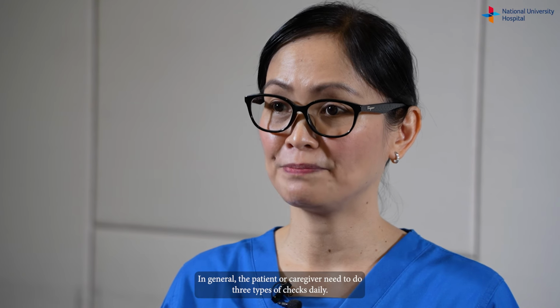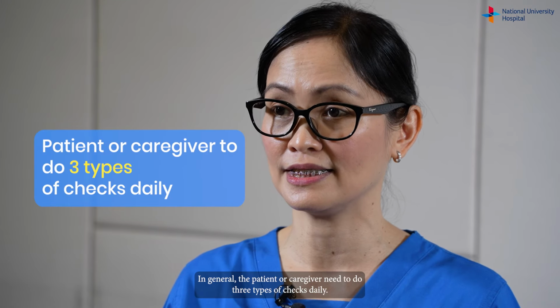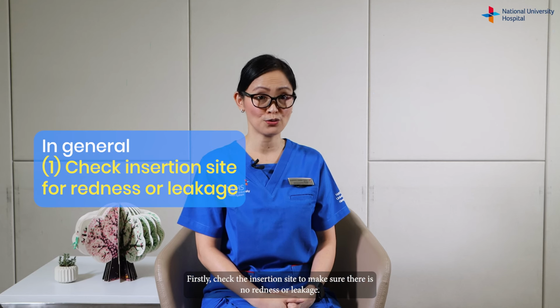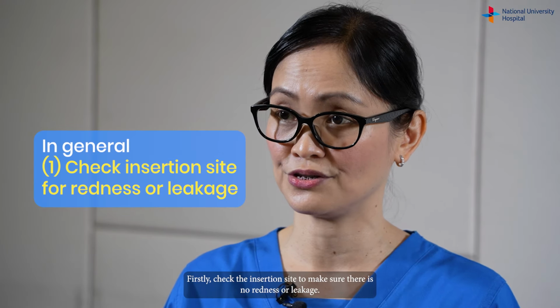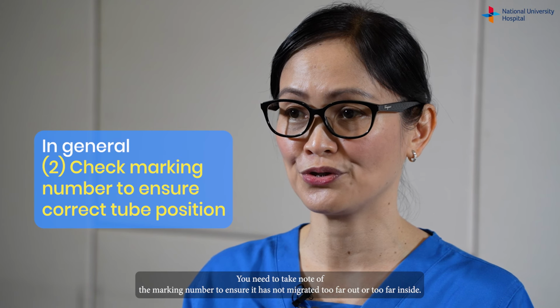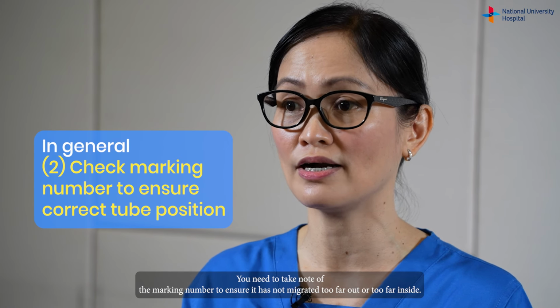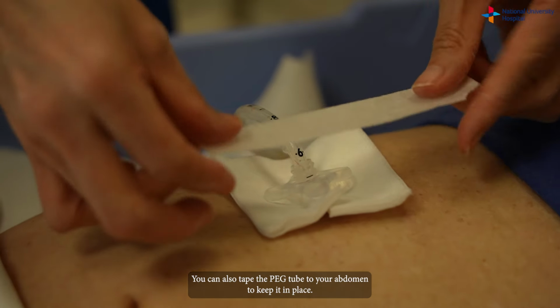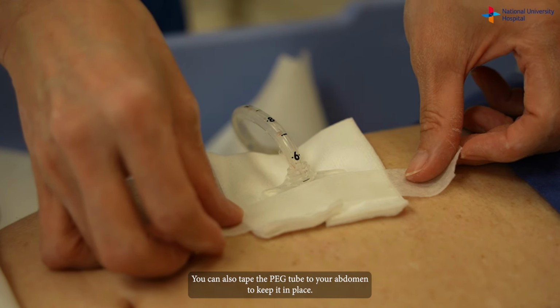In general, the patient or caregiver needs to do three types of checks daily. Firstly, check the insertion site to make sure there is no redness or leakage. The second check is the tube position. You need to take note of the marking number to ensure it has not migrated too far out or too far inside. You can also tape the PEG tube to your abdomen to keep it in place.